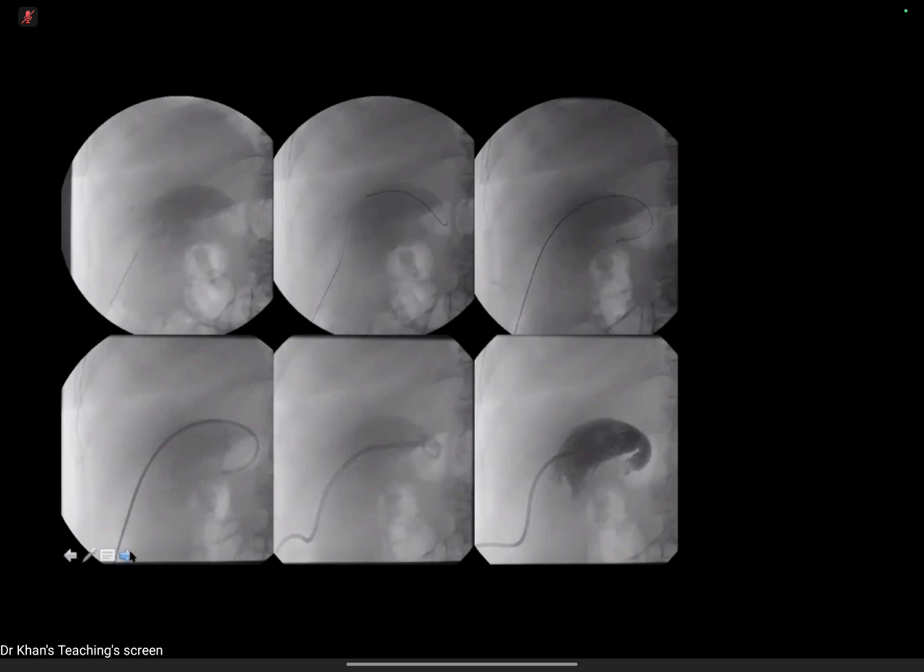So again, the principle is the same, Seldinger technique, or the other principle is the single step trocar technique, which is in some instances doable when it's a very distended gallbladder and it's very superficial. But again, Seldinger technique is preferred for safety reasons. Good.